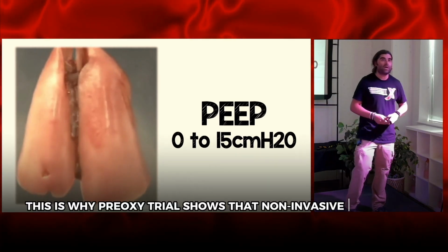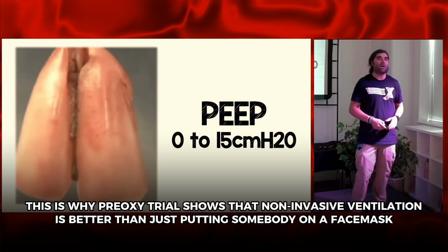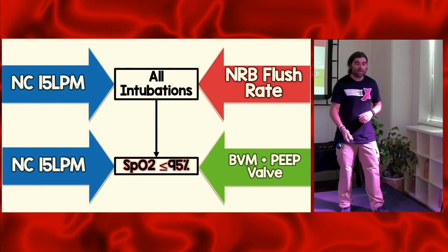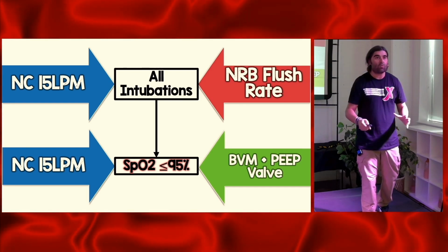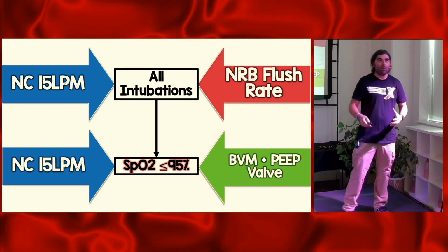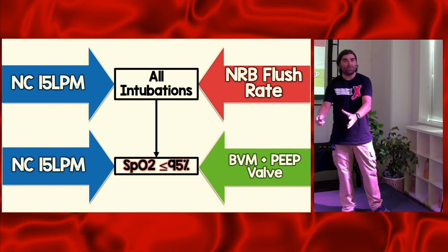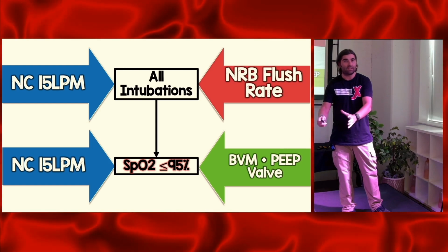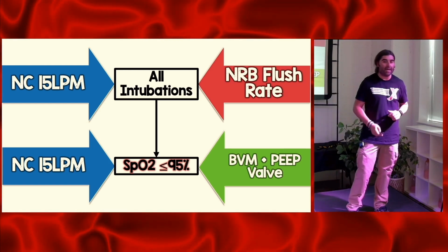And it's probably why the PreOxy trial shows that non-invasive ventilation is better than just putting somebody on a face mask. So this is kind of my workflow of how I start all my intubations. And as I work through, if I'm not achieving what I need to get, remember that green arrow. In an ideal world, it's non-invasive ventilation, but in some environments, I don't have that luxury. So this is my second backup.